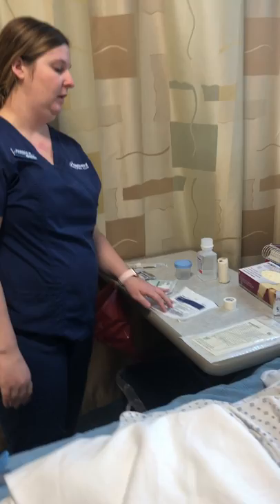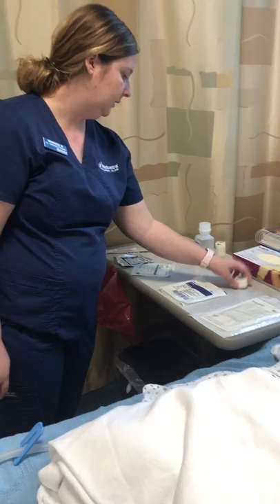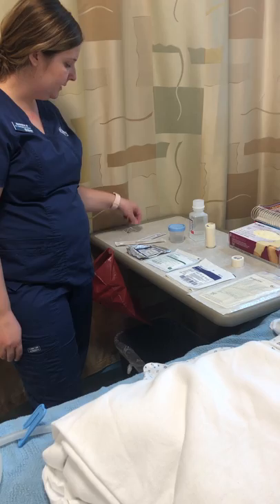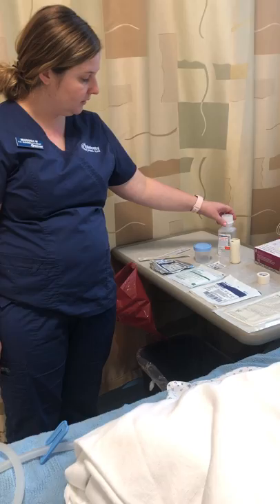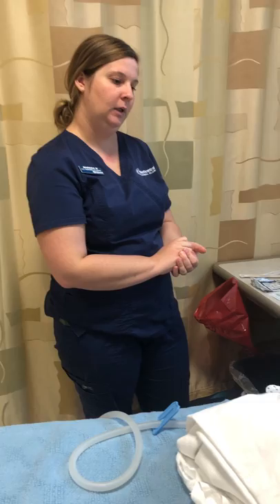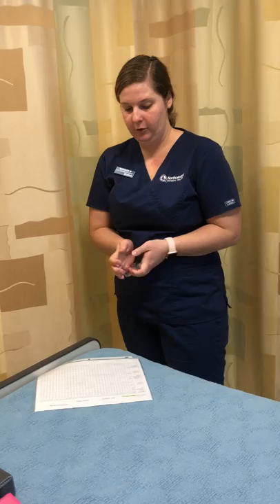I'm going to gather my supplies first. I have clean gloves, hand sanitizer, and tape for a label to label the dressing when I'm finished. I have the tape for the dressing change, sterile gloves, cover sponges, drain sponges, Vaseline gauze, cotton tipped swabs, skin prep, a sterile container, and a bottle of sterile solution. I also have a biohazard bag for any garbage from the old dressing. Then I'm going to wash my hands before entering the room.